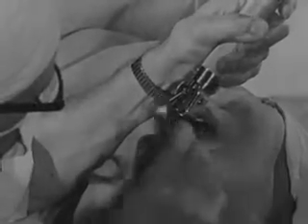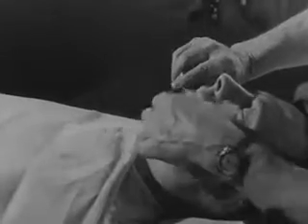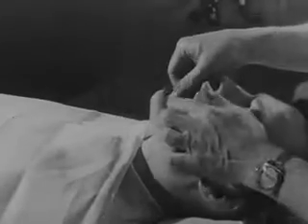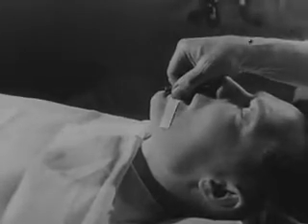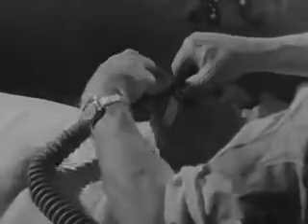Once the laryngoscope has been successfully guided into position, pass the tube down. When it is in the trachea, and there should be no doubt about this when a laryngoscope has been used, the metal connection should be strapped to the patient's face by adhesive plaster. The hose from the anesthetic machine is then fixed in position.